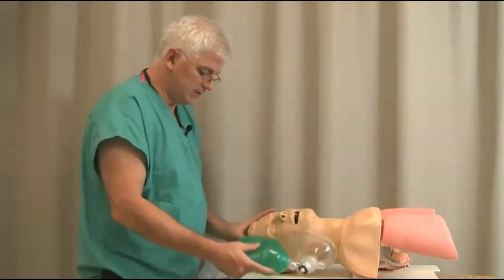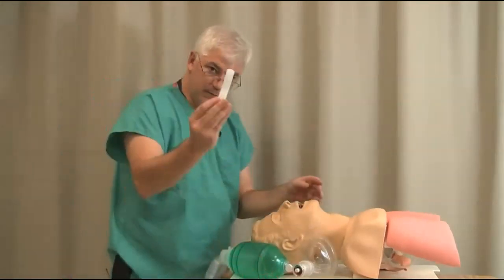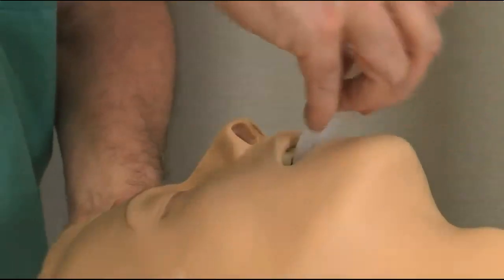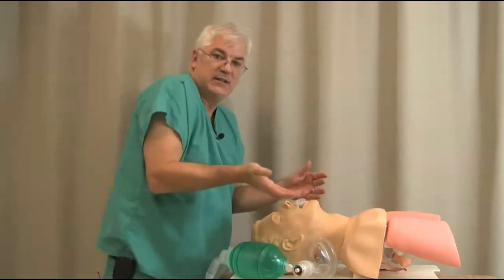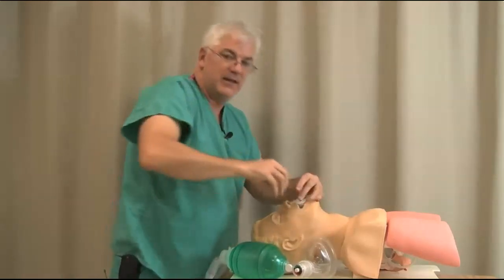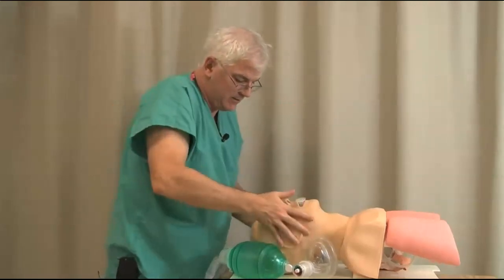And we have airway adjuvants too. You can always put an oral airway in. There's 100 ways to put in an oral airway, but the idea is to make sure it's lifting the tongue up. Don't just jam it in there, in which case it could actually worsen things. So make sure this is like that.